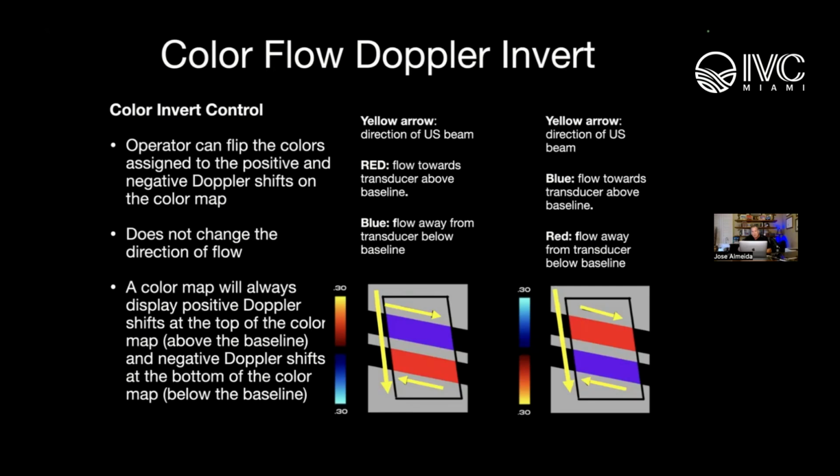That way they don't have to be digging into each image, looking at the color bar, looking at the direction, seeing which side the transducer is on based on steer, doing all the work to interpret that image that we just described. They just kind of want to look at the image and here's the velocities. This red is artery, vein is blue. Is that kind of the way you guys are thinking as you're doing the study, trying to make it easier for the interpreter? Yes. Yeah.